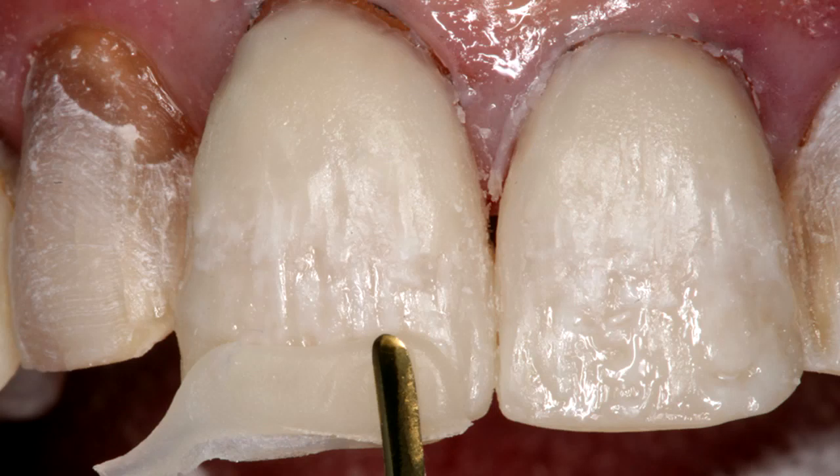Another reason I like using composite instead of porcelain is that I think it's just easier to block out the discoloration, because when using composite we can wash the block-out as we layer. Now, don't get me wrong — blocking out dark teeth is really difficult regardless of which material you use. I just find it more predictable, if I'm not crowning the tooth, to use composite instead of porcelain in the veneering technique.